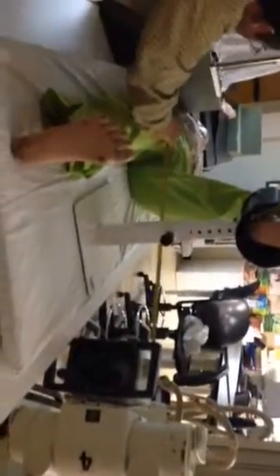Okay. All right, do we have 40 inches? We'll probably have about 44, and that's the best we can do. And make sure that the beam is horizontal. It's 47. That's the closest we can get. So we're gonna take that.